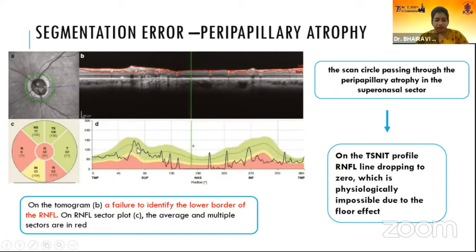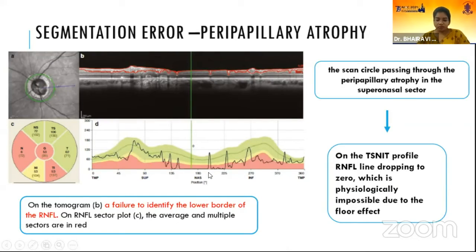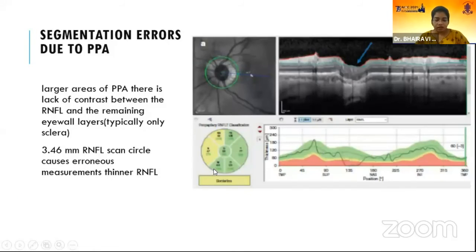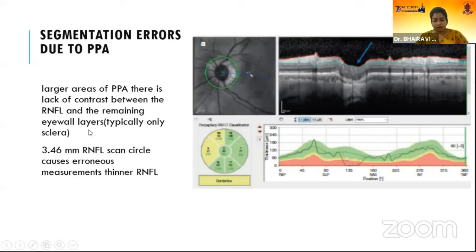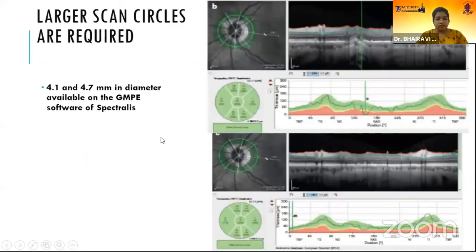In the superior nasal quadrant, the RNFL line is dropping to zero, which is physiologically impossible due to the floor effect. In larger areas of peripapillary atrophy, there is lack of contrast between RNFL and the remaining eyeball layers. The standard 3.46mm RNFL circle causes erroneous measurements in these areas, and a larger scan circle can be used in the presence of PPA, which is available in certain Spectralis software versions.